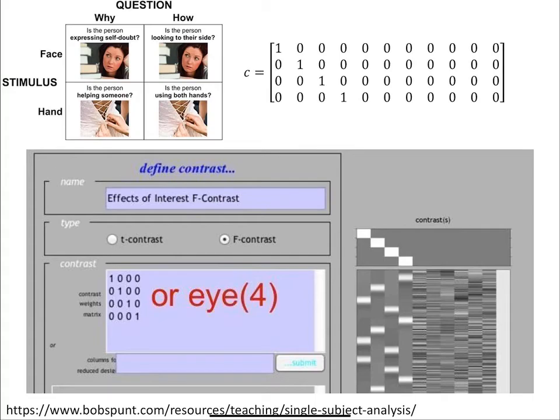Here's another example from an SPM thing where it also has 4 explanatory variables. And in this case, the 4 variables are here. And all these other 7 variables are confounds, which we'll talk about on Wednesday. So in this case, the F matrix looks actually different.